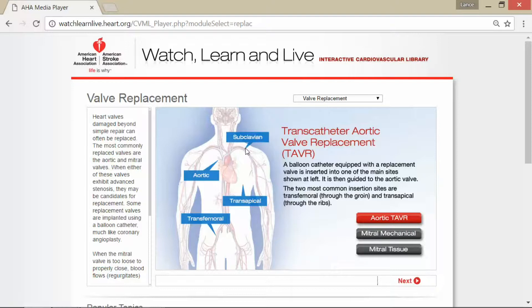The diagram shows the different insertion sites: the subclavian, the aortic, the transapical, and the transfemoral. A balloon catheter equipped with a replacement valve is inserted into one of these main sites and guided to the aortic valve. The most common insertion sites are transfemoral, through the groin, and transapical, through the ribs.